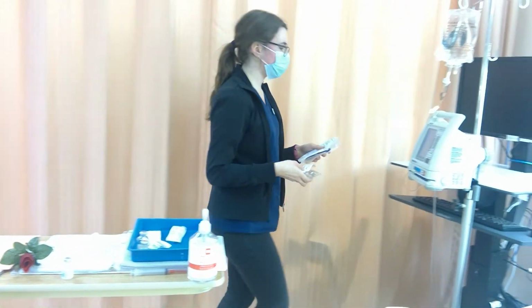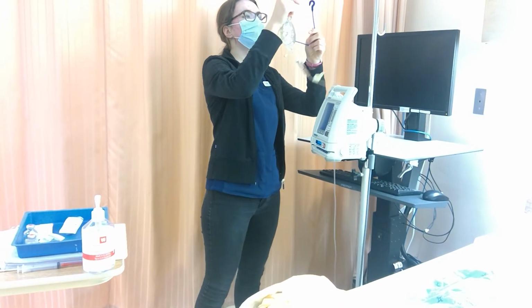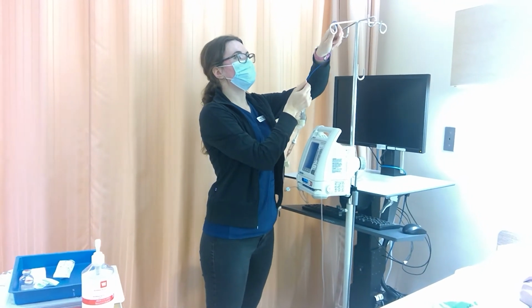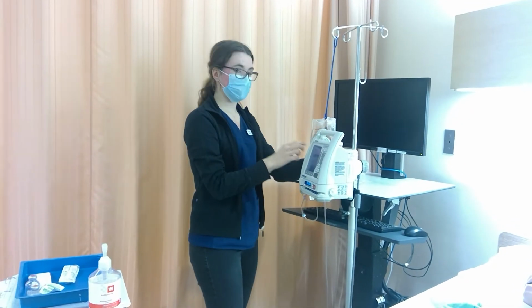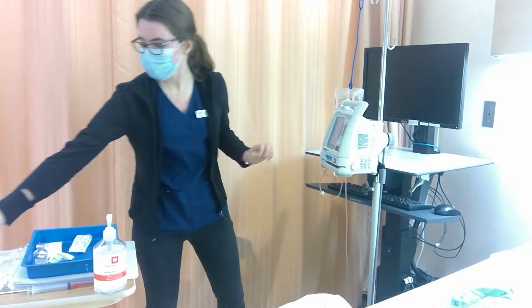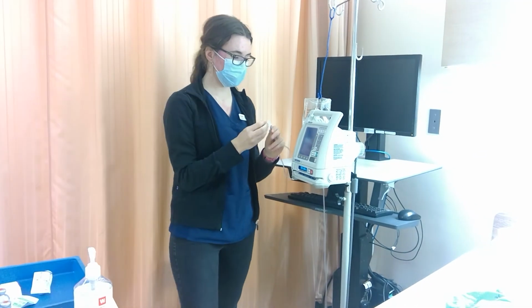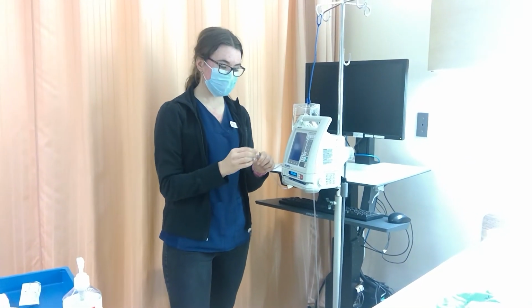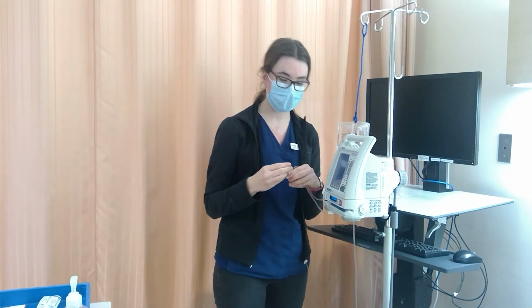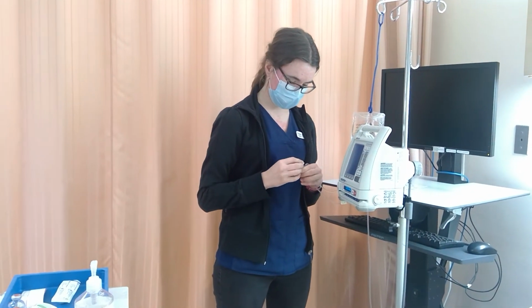So now that we've done that check, I'm just going to start setting up my medication. So first thing I'm going to do is hang my bag lower, just because we want it lower than that secondary. And then we're going to take an alcohol swab, and we're going to swab this for 30 seconds and then let it dry for 15. I always like to use the port up here for mini bags so that if I do need to give an IV push, say if he does have a reaction, if he needs a PRN medication, then that's going to be open and we're not going to have to make a saline lock and it's just this whole thing, you know?